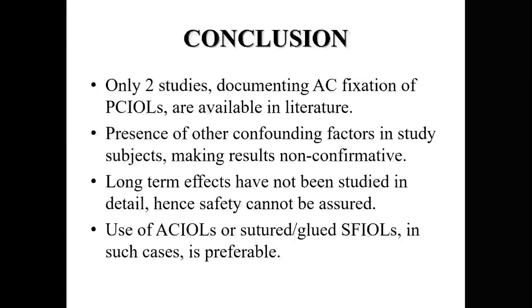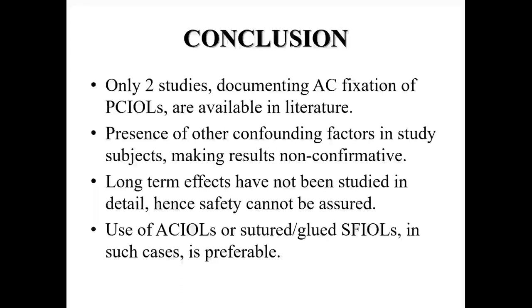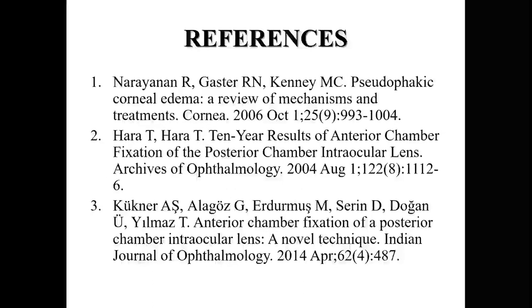So I would like to conclude by saying that only two studies documenting AC fixation of PC IOLs are available in literature. Presence of other confounding factors in the study subjects makes the results non-confirmative. Long-term effects have not been studied in detail, hence the safety cannot be assured. And use of AC IOLs or sutured or glued SF IOLs in such cases is always preferable. These are my references. Thank you.